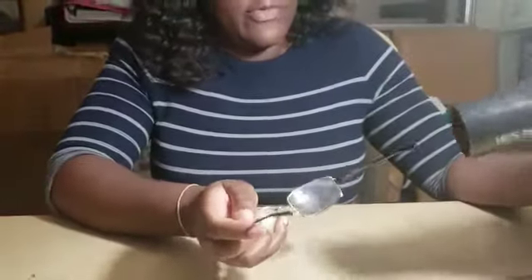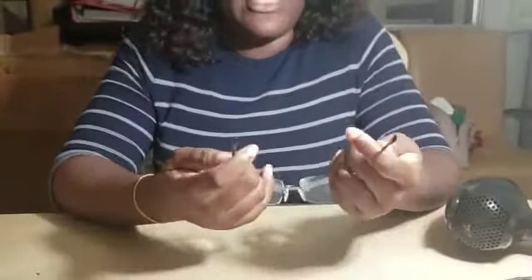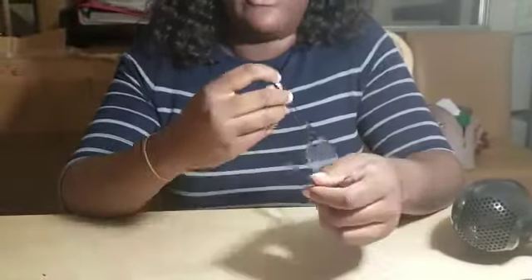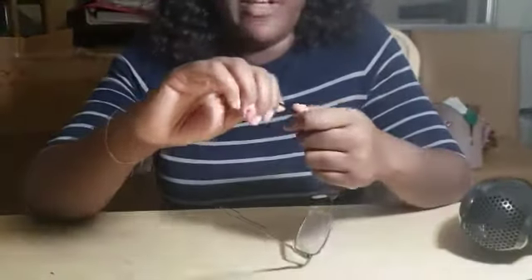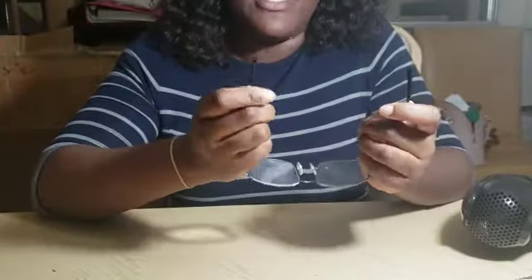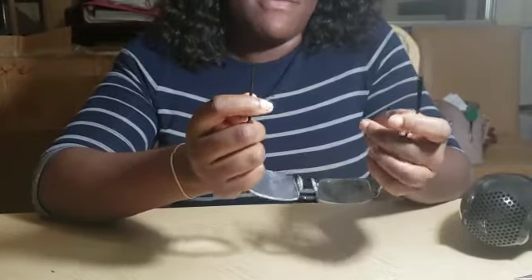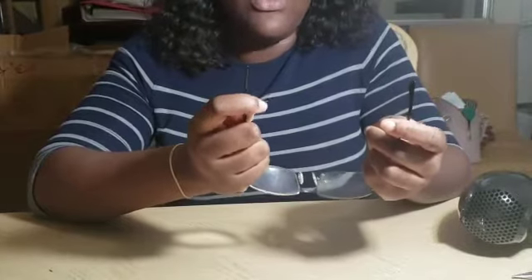Once we've done this for three to five minutes, we need to do our temple bends. We're going to use our thumb to get it at a 45-degree angle. Bend it on one side and then try to make the other side the same, because you don't want one to be too short or too long.